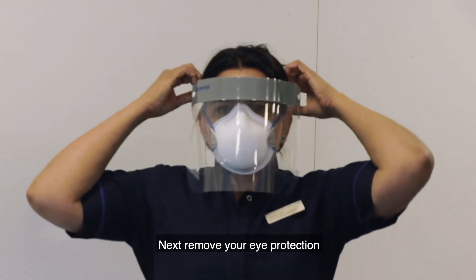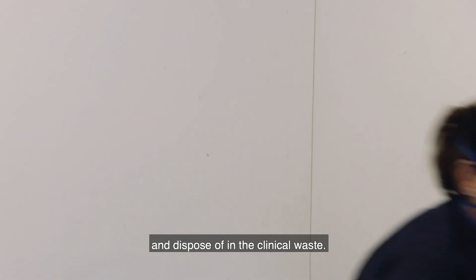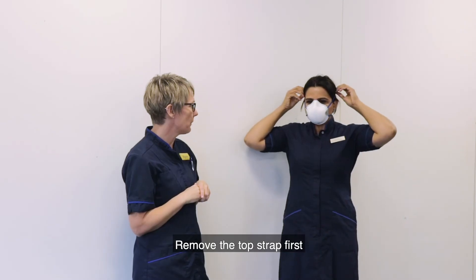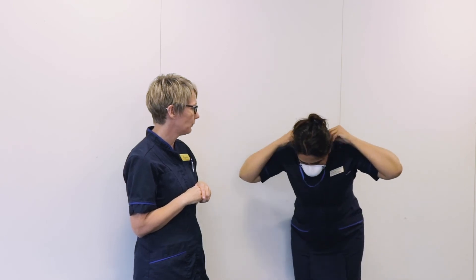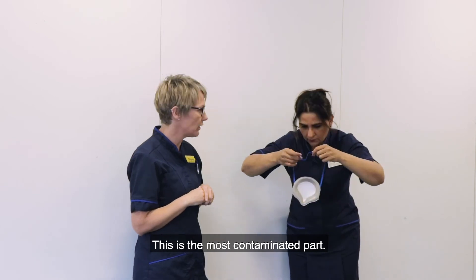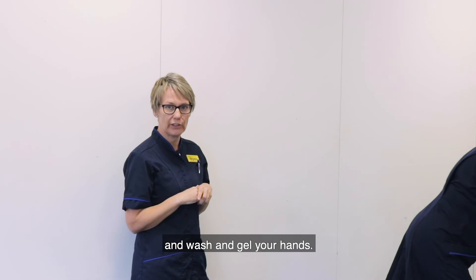Next, remove your eye protection. Do not touch the outside — remove from the back and dispose of in the clinical waste. Then remove your mask. Remove the top strap first so the mask falls gently, and then the bottom strap, not touching the outside of the mask as this is the most contaminated part. Dispose of it in the clinical waste and wash and gel your hands.